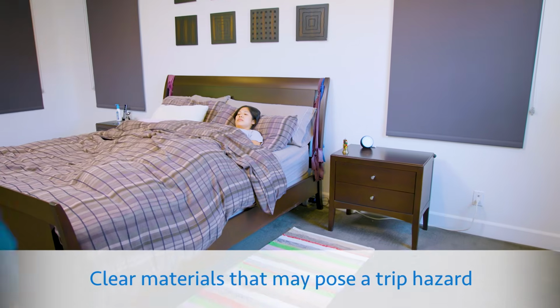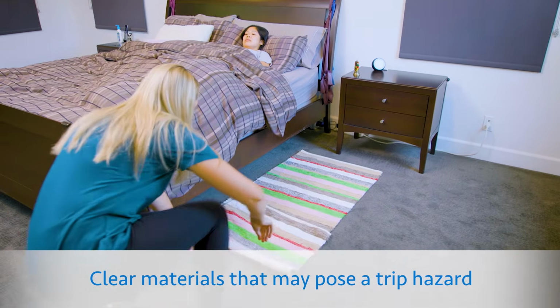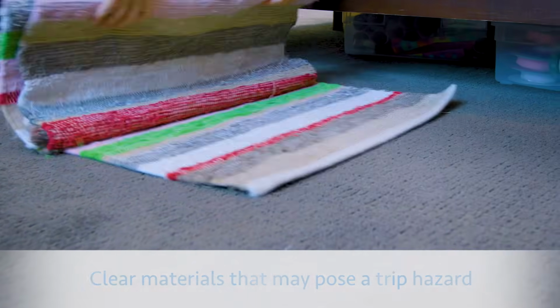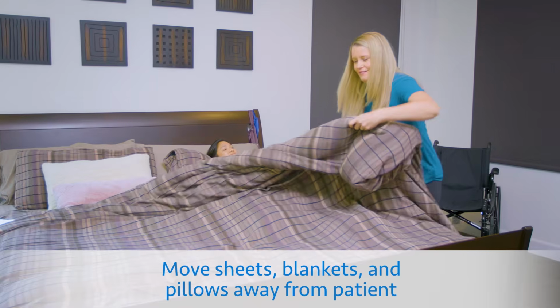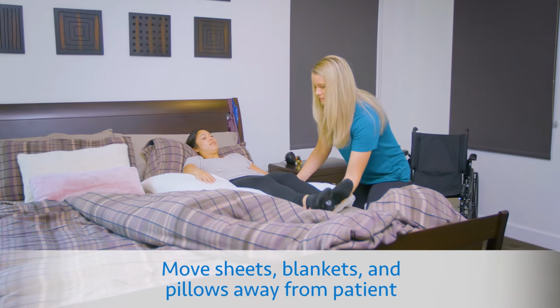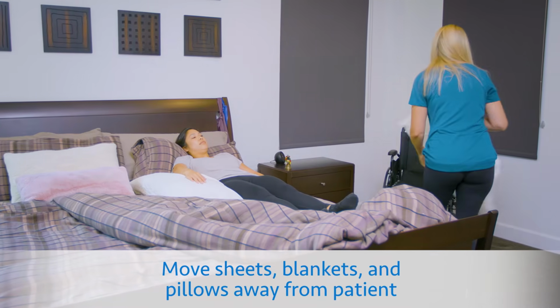Clear all unnecessary materials that may pose a trip hazard. It is important to have a flat and clean surface to reduce the risk of slipping or tripping. We recommend that rugs be removed throughout the house to prevent tripping. Move all sheets, blankets, and pillows away from the patient to ensure a clear space for movement, and to avoid any interference during bed mobility or the transfer.